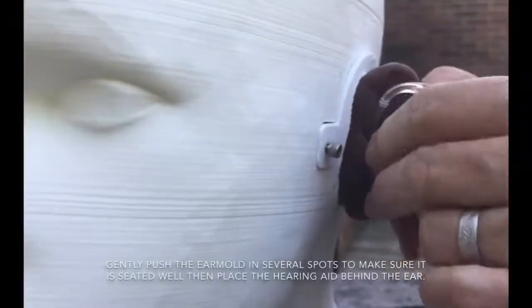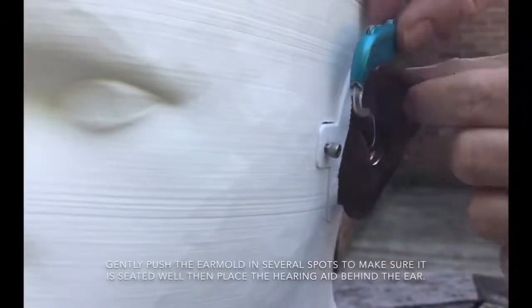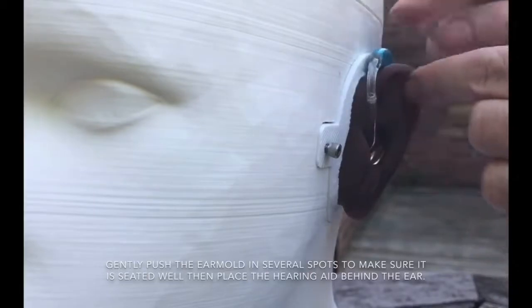Gently push the ear mold in several spots to make sure it is seated well, then place the hearing aid behind the ear.